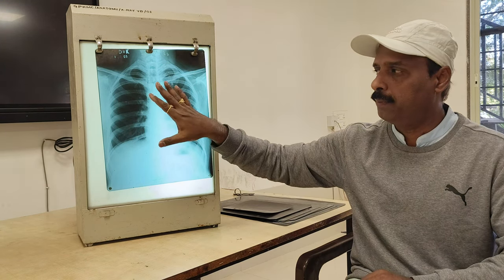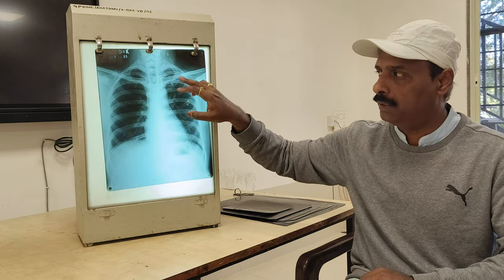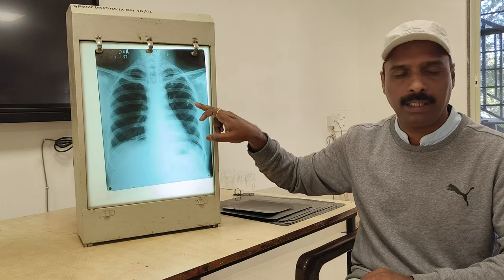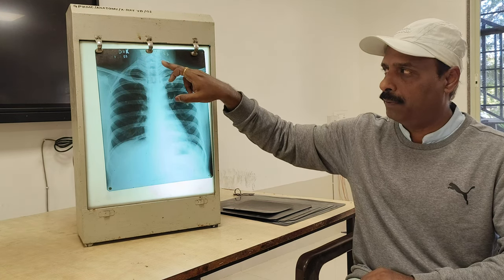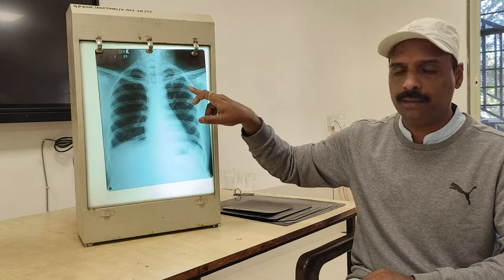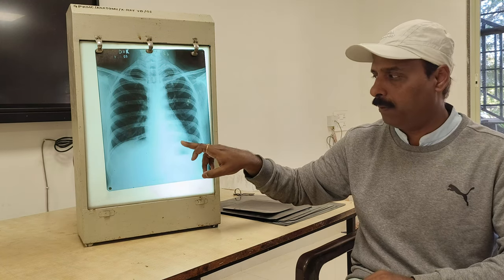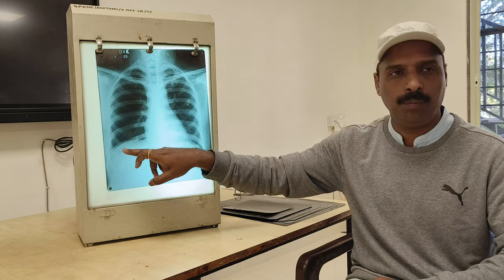This is the X-ray you have to tell. Identify the X-ray means you have to tell that this is a PA chest X-ray. Then in the PA chest X-ray, what you have to mention: first, centrally there is the shadow of the heart. Then on both sides you are going to get the lung shadows. Then you have the clavicle, the right and left clavicle on both sides. And posteriorly in the upper part you get the vertebral column. Then below, you have the ribs, seen on both sides. Then here we are going to get the right dome of the diaphragm and the left dome of the diaphragm. Very important.